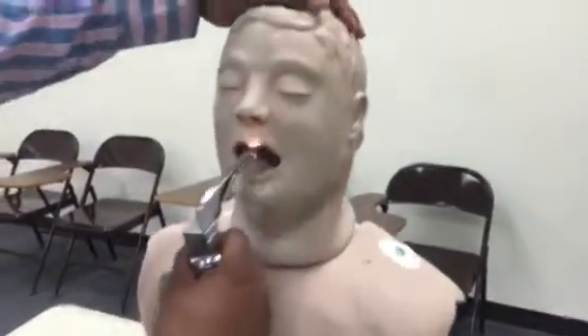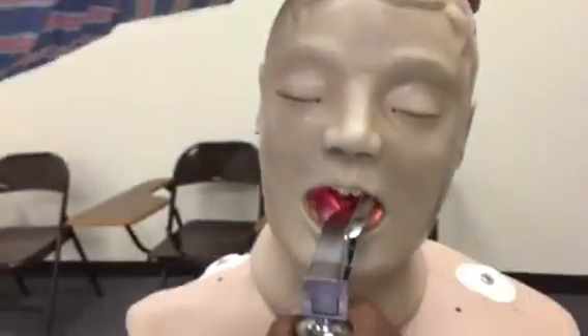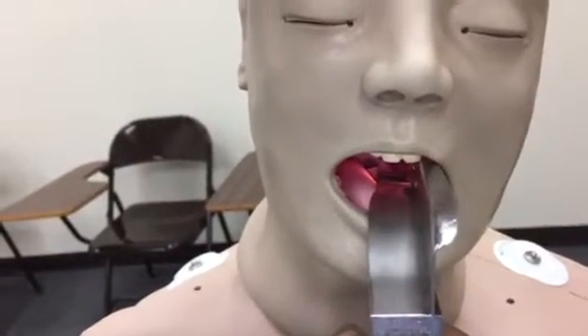So when I go in, we're going to give you a view of what we want to see. So this is what we want to see. That small hole you see right there — that's actually the vocal cords in this patient, which is basically an ALS mannequin.